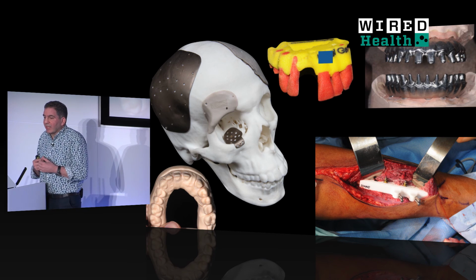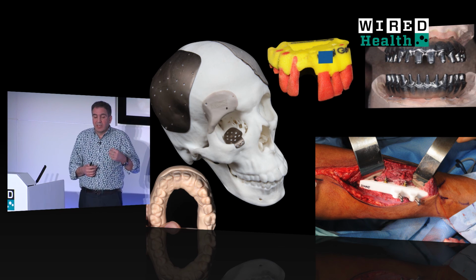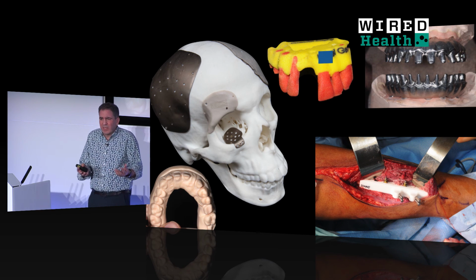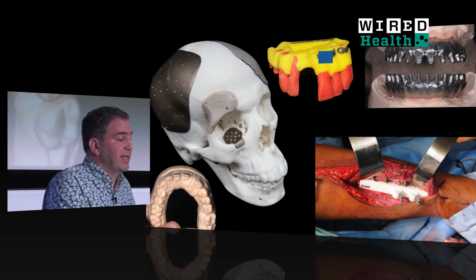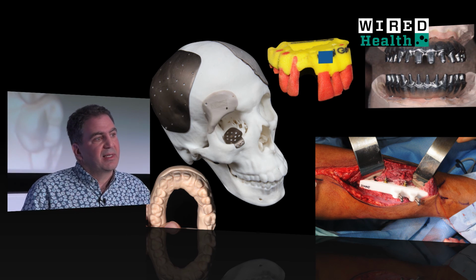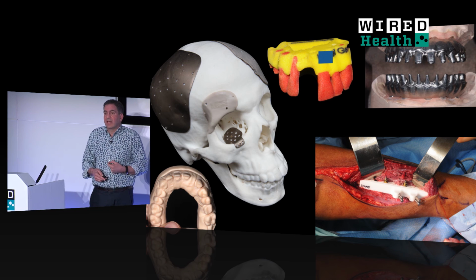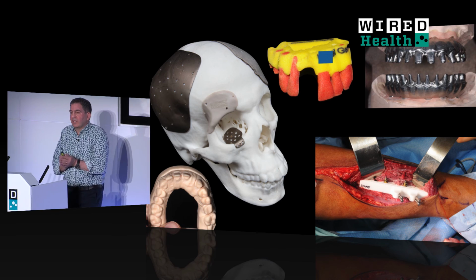But 3D printing allows us to do so much for our patients. We can make implants, make the kind of models that dental restorations sit on. That sounds terribly mundane and boring. They used to be made from plaster of Paris. Now they're 3D printed. We can make the kind of metal structures that later get covered with porcelain. We can make ceramic frameworks, and we can make cutting guides and drill guides that allow us to pre-plan our surgery and carry it out with precision.